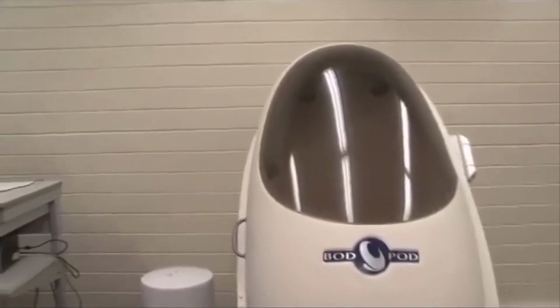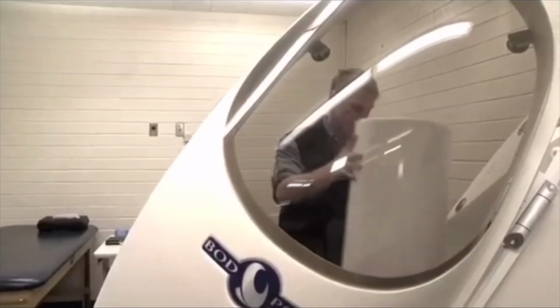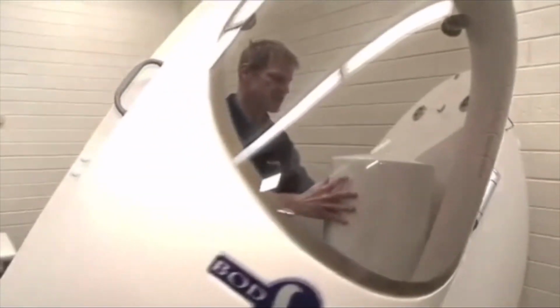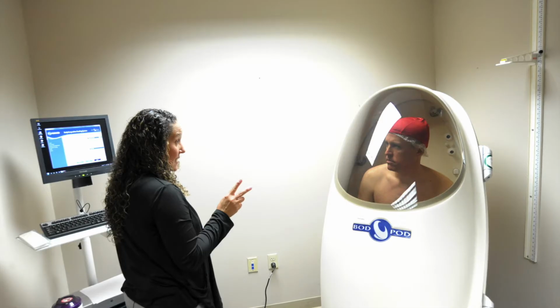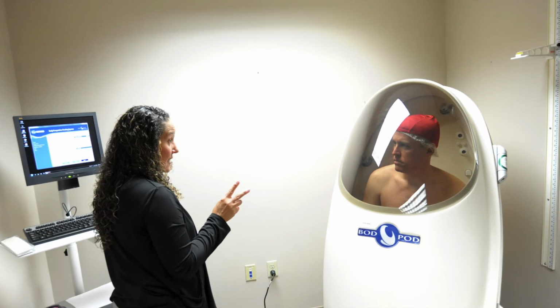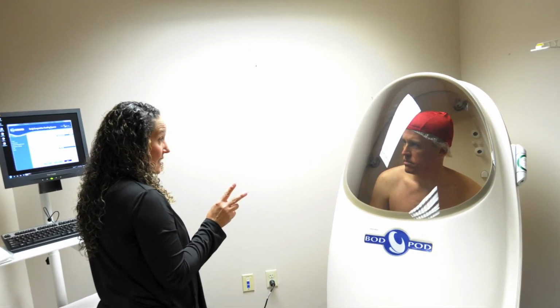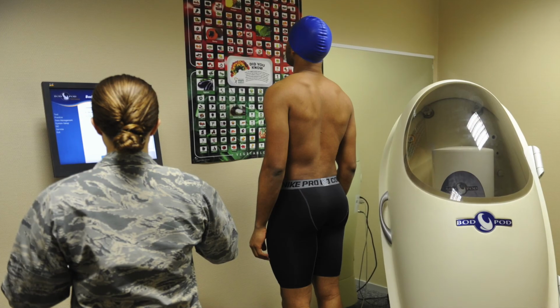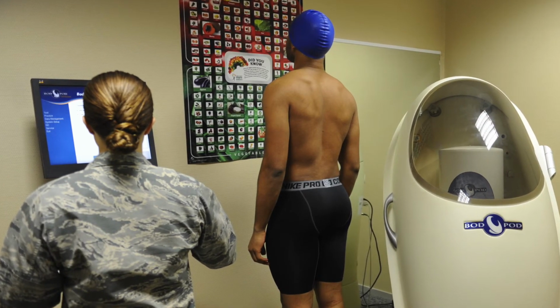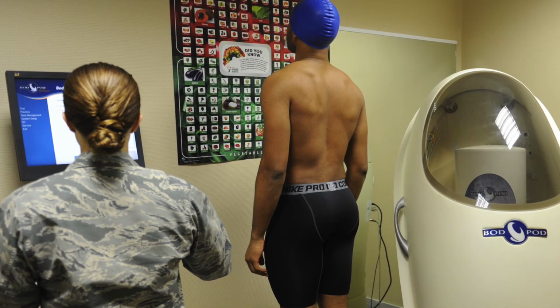Before starting the test, calibrations must be performed. First, the chamber is measured while empty, and then with a 50-liter calibration cylinder inside. 2 measurements are also done while the patient is inside in order to assure accuracy. If these measurements do not agree, a 3rd measurement may be taken. Patients are asked to wear tight-fitting clothing or swimsuits as well as swim caps over their hair in order to minimize air getting trapped.